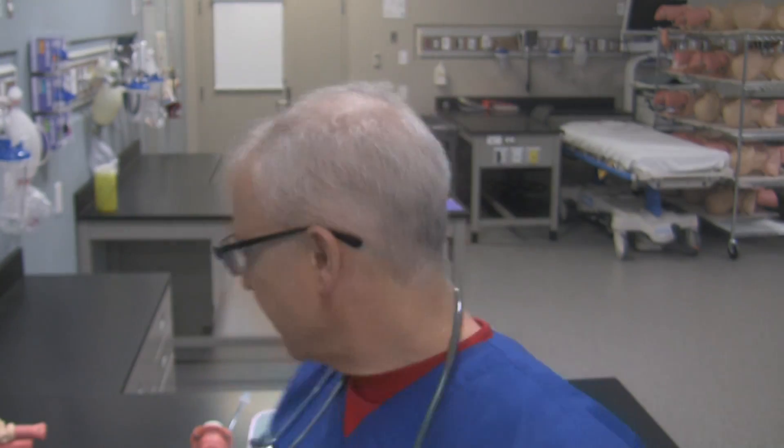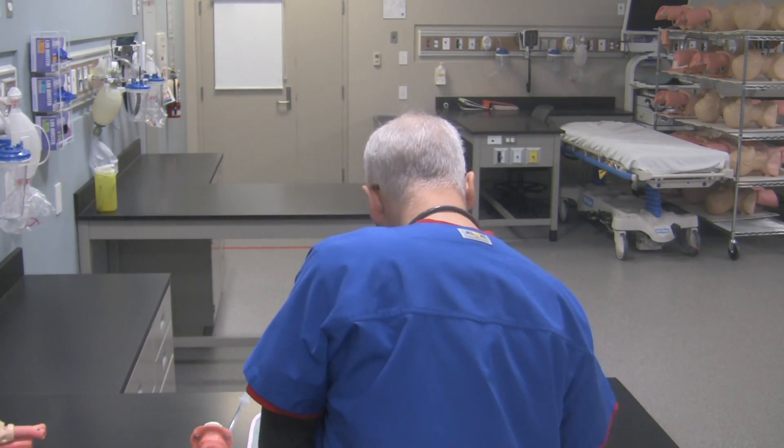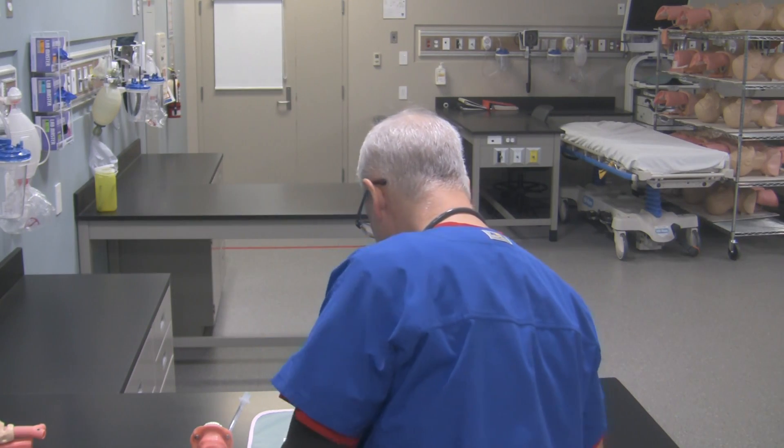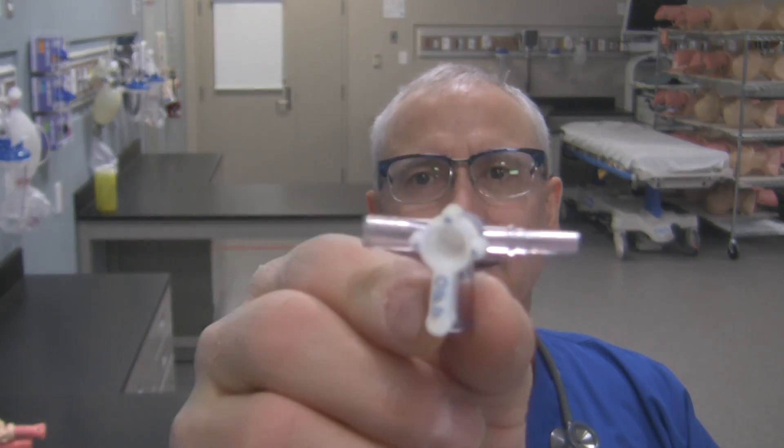So when you want to use it, if you need PPE or if you're doing something sterile, make sure you're wearing the appropriate PPE. Grab the stopcock, open the packaging, and what you're going to find is a stopcock that's going to look something like this, or one that looks like that.